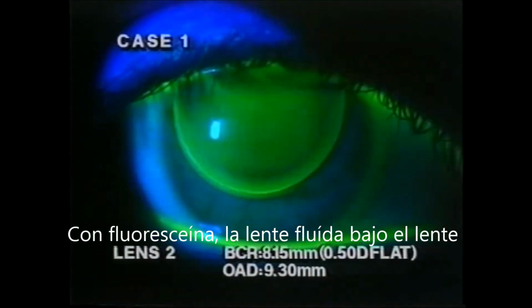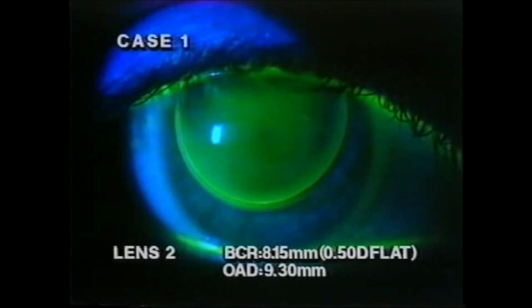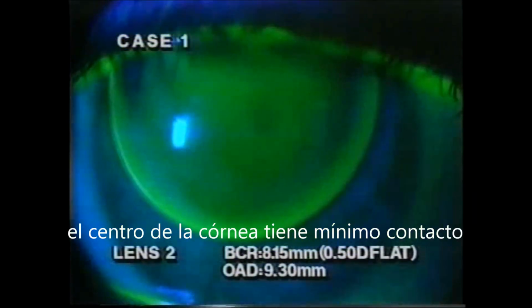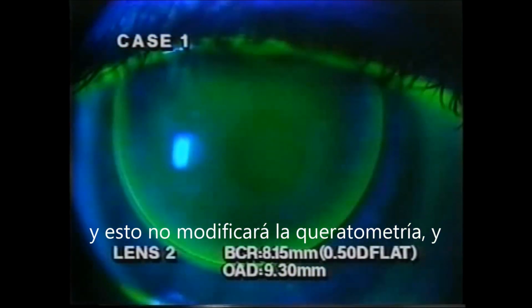With fluorescein, an on-K alignment fit is observed with the pattern presenting as diffuse and uniform. Though the base curve radius is flatter than K, the typical flat pattern isn't observed for the following reasons. There's a slightly superior fitting relationship. The corneal topography is not accurately predicted within the small area measured by keratometry, and the lens diameter is larger than average.